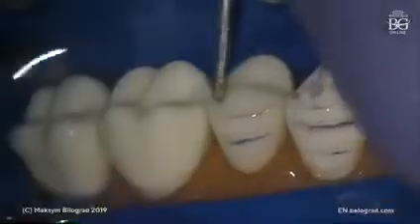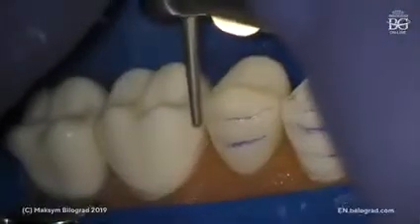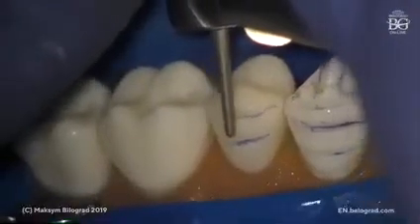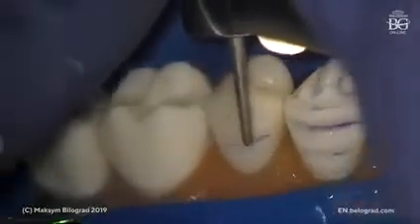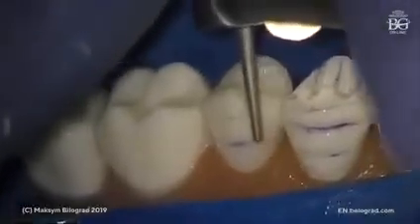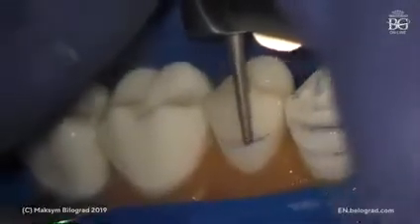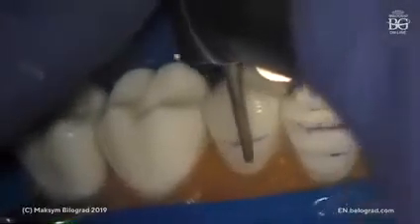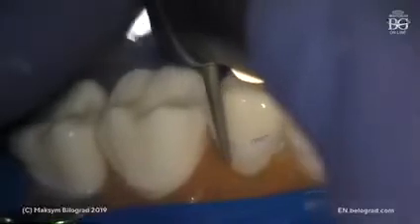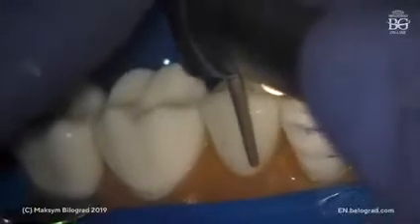Once we have our cusp prepped, we will continue with planes, the same as we did for the molar tooth. This will be the incisal plane, let's say. That will be the middle plane. And there will be the initial finish line and cervical preparation.